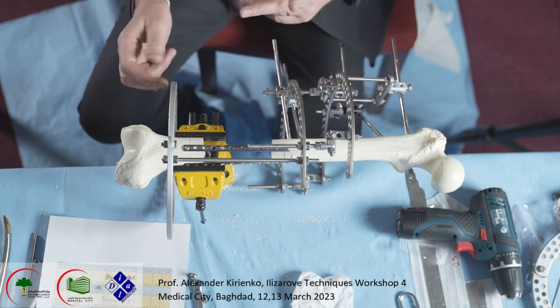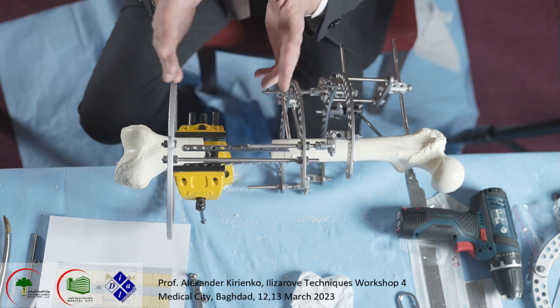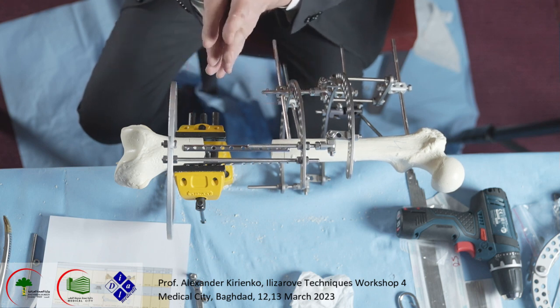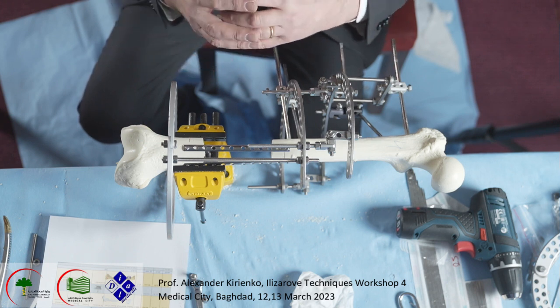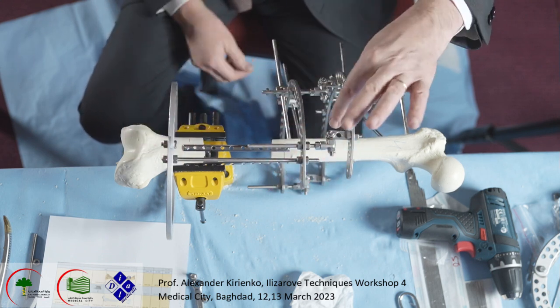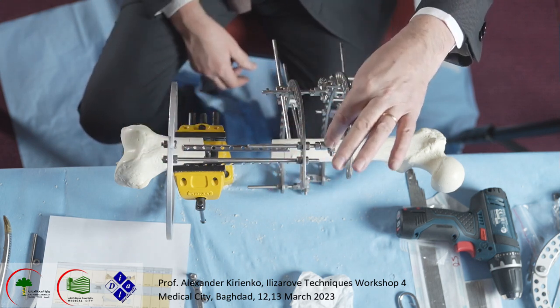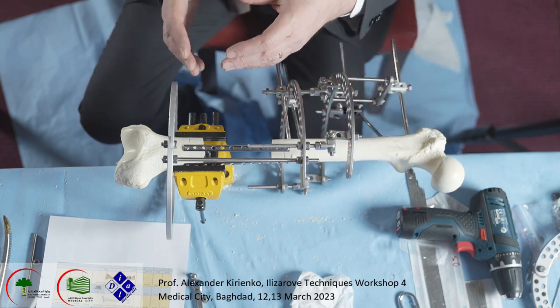But maybe easier in this case, because the defect is bigger, we do compression slowly. When we arrive in contact, you may change the rods, put shorter rods, and build these biplanar or monoplanar hinges to correct deformity of the distal femur.